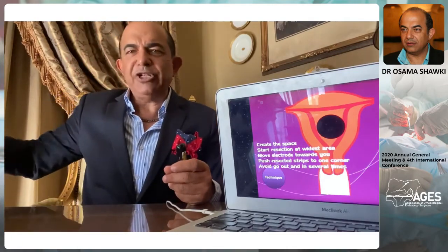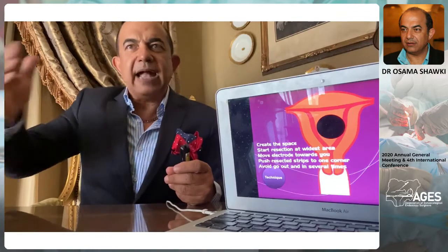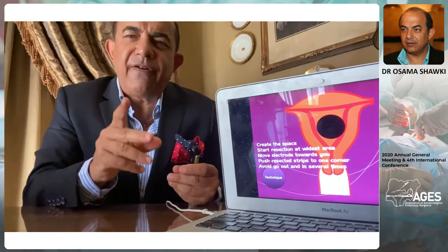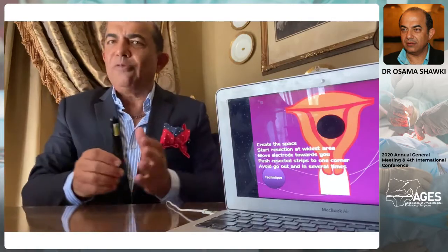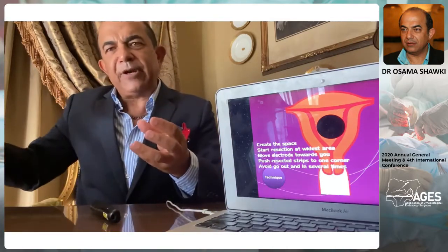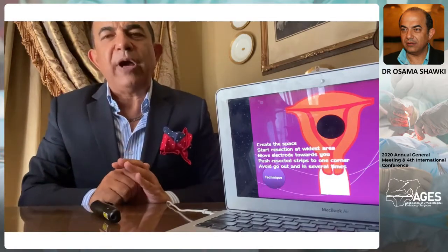If you raise the machine pressure, say the machine is now showing 280, and the blood starts to disappear and the field is clear, this means inside the uterus you are above 100 and you are tamponading the vessels. And at that moment, the absorption of fluid is at risk. Fluid overload can happen if you continue for a long time. So you have to raise the pump pressure gradually until you tamponade and stop the bleeding while operating.